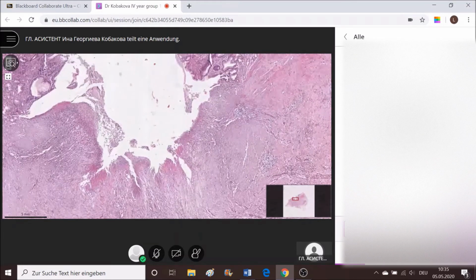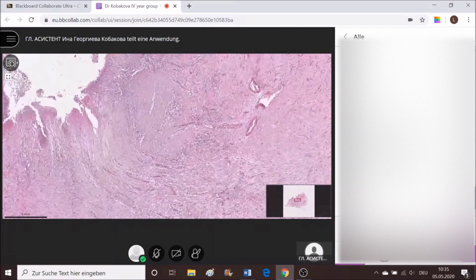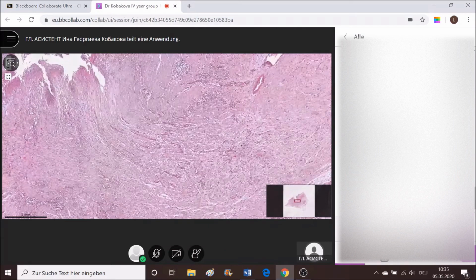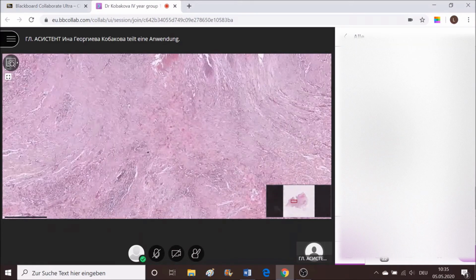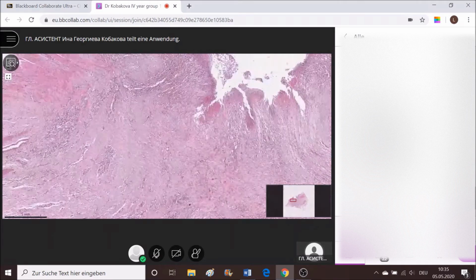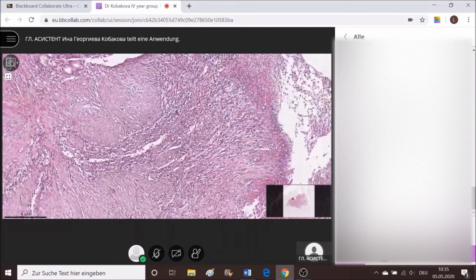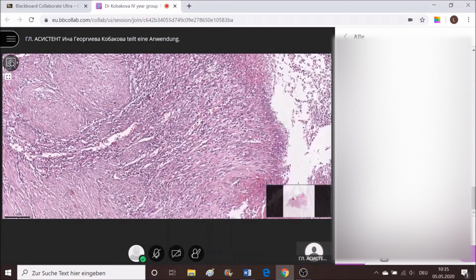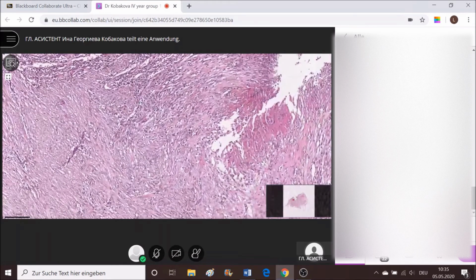It is chronic because there's lots of chronic infiltrate that we can observe here in the ulcerative layers. Also, we can observe lots of granulation tissue, which is majorly the tissue of repair. It's marked best here. You can see small newly formed vessels, huge clusters of lymphocytes, some portions of macrophages, which are in the form of epithelioid cells.